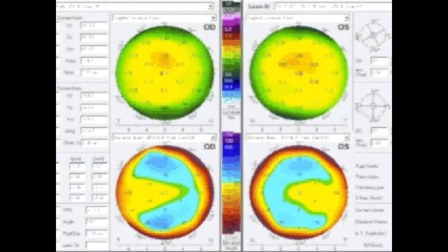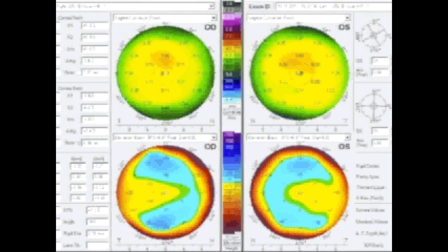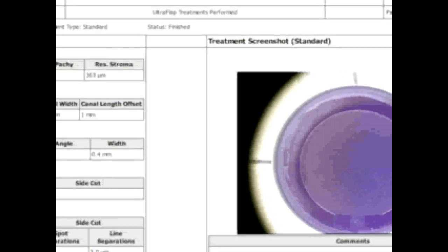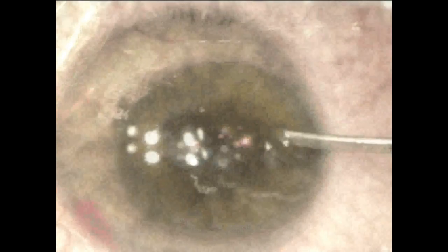We're going to the surgery video. This is both eyes of this hyperopic patient. We'll see the treatment data in a few seconds — we're treating a very significant hyperope at plus seven, minus one and a half diopters of astigmatism. The FS200 patient interface suction goes on; note compared to the pupil how the ablation center is shifted to the left, which is nasal. You can also see on the FS200 report the actual femto flap and the pupillary aperture, showing how the flap is de-centered nasally to match our topography-guided treatment.